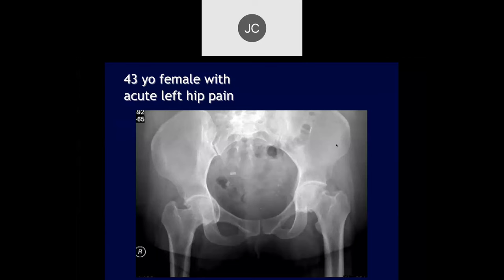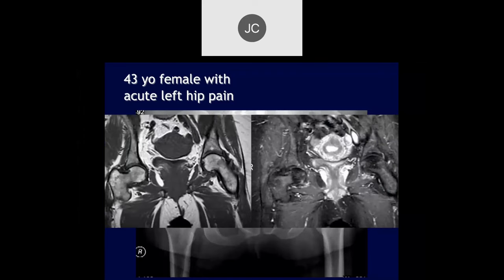Robert: We have a 43-year-old female with acute left hip pain. There's definitely some degenerative change of the left hip with some femoral head and neck junction osteophytes, and it looks like a deep acetabulum, kind of bilaterally. I think a little bit of protrusio acetabuli on both sides. Here's what the MR scan looks like — probably coxa vara on both sides.